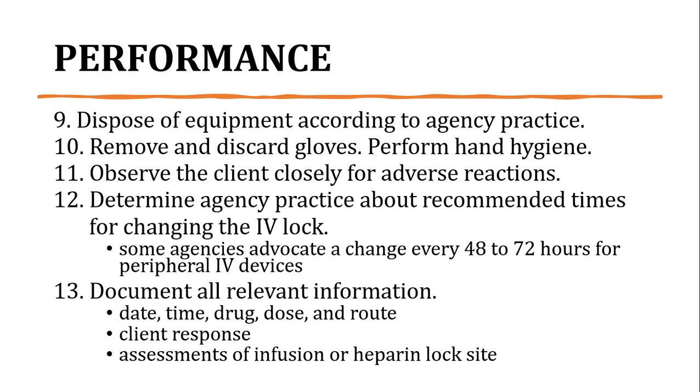Observe the client closely for adverse reactions. After the medication, we still need to assess the client for adverse reactions that they may experience after the administration of the medication. Then determine agency practice about recommended times for changing the IV lock.